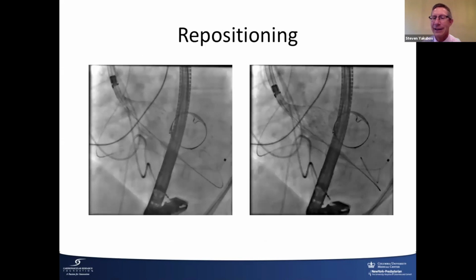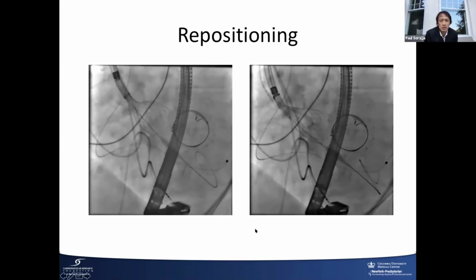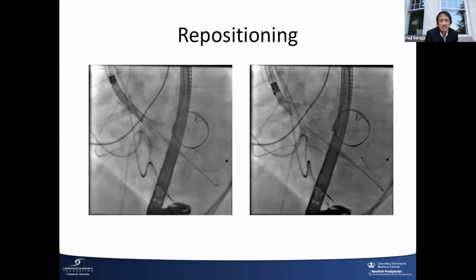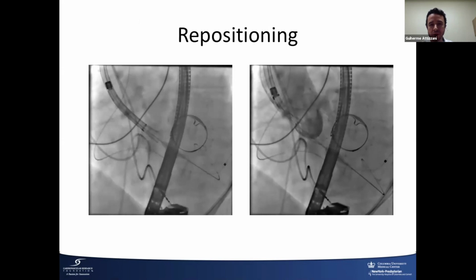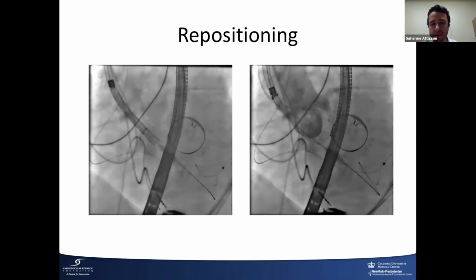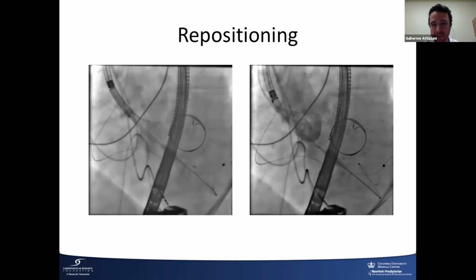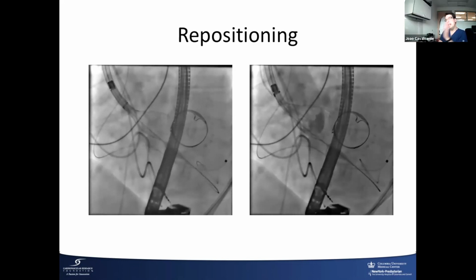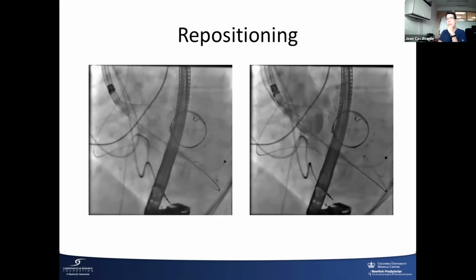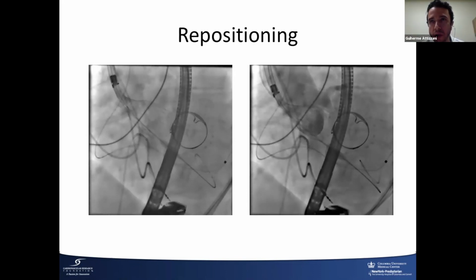I like it. A quick question for Guy. So your high implant approach, you do that regardless of the aortic valve calcification? Yes, I would have been happy probably with this initial. I think the initial position that Sushil got was very good there. And Guy, what if you deploy, now you have PVL and you got important PVL then? What would you have done then? Because you're already high.